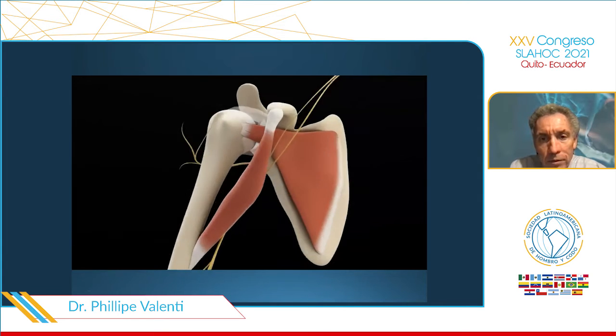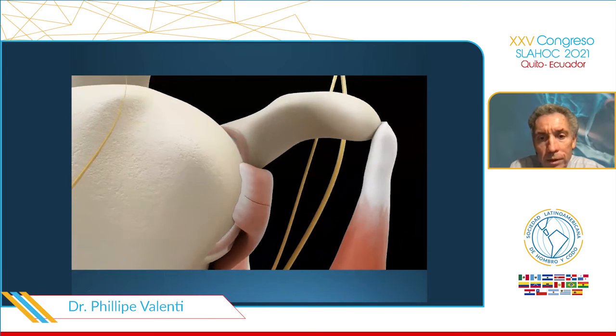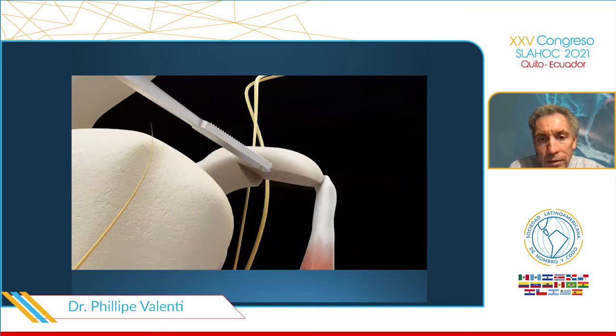This is the axillary nerve, the musculocutaneous nerve, the subscapularis. The first step is to prepare the anterior glenoid rim, which should be flat because it's very important to have a good match between the inferior process of the coracoid and the glenoid rim. After, with a flat burr, we prepare the inferior part of the coracoid process. It's the most difficult time by arthroscopy.